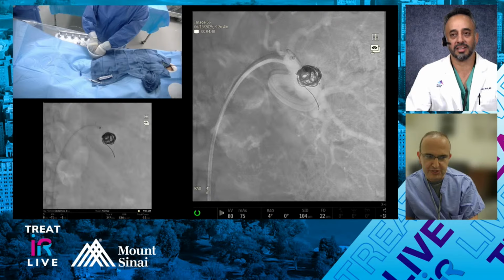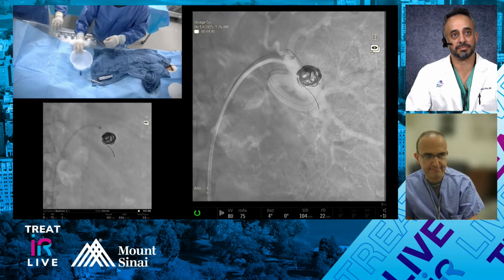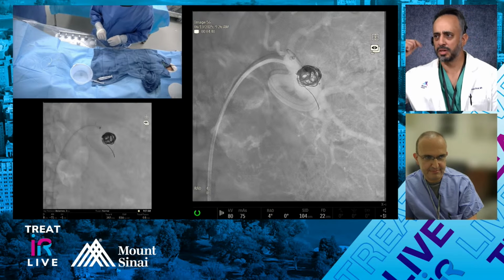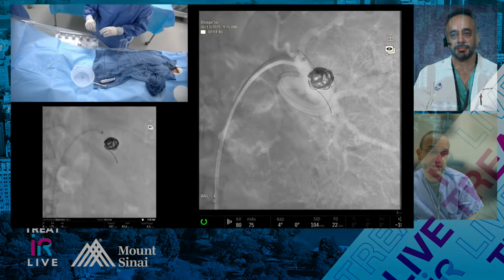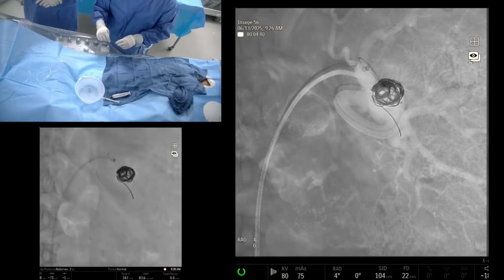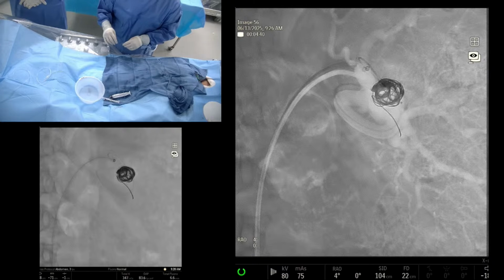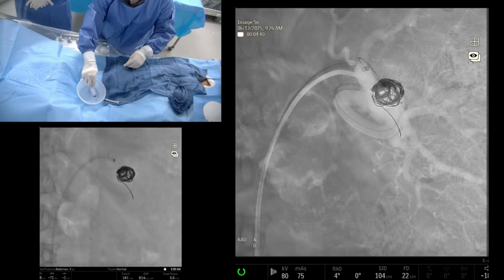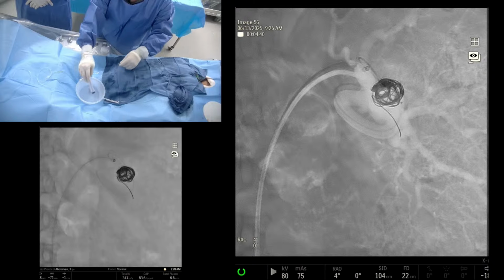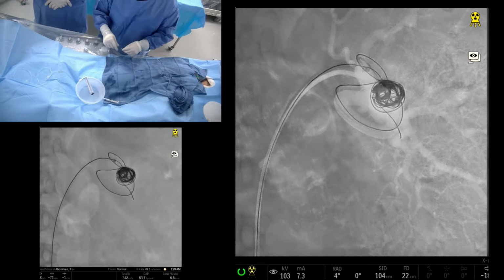Just one question: those embolization coils are made out of titanium? What are they made out of? I'm just trying to see how you're going to follow up with MR. Good question. So the coils themselves, are they platinum? Yeah, they're platinum. So they do have artifact when it comes to following up with CT. So actually, Emil, the protocol that you came up with is still in vogue here. And so we follow up with an MRA for these patients to make sure that it's completely occluded.